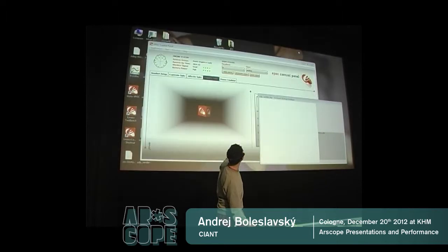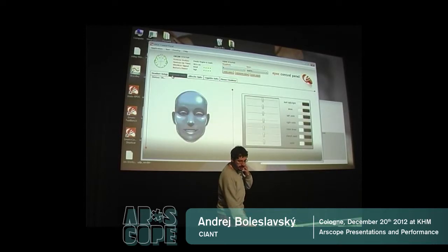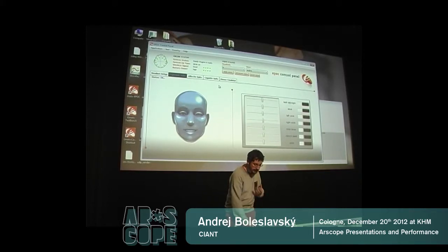And on top of this, there's an application which contains very sophisticated signal processing algorithms. And this application can detect what my expression on my face is, if I blink or close my eyes, or when I clench my jaw.